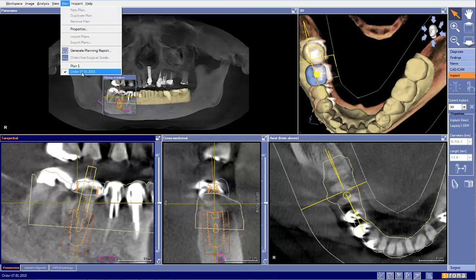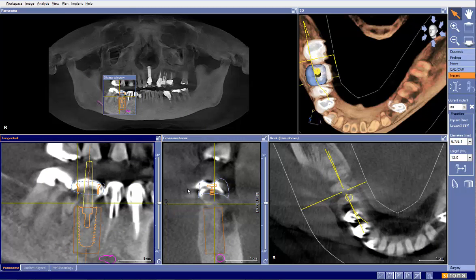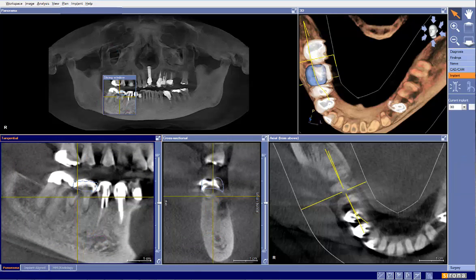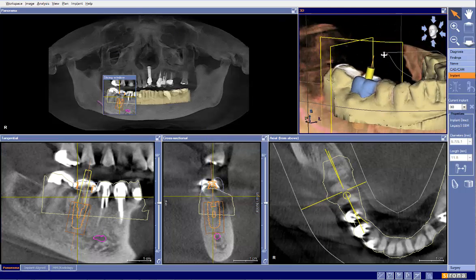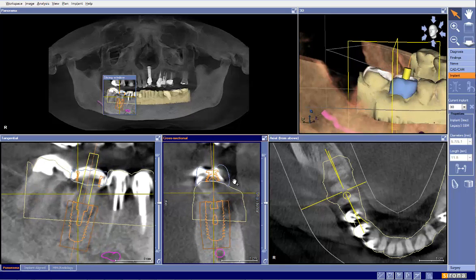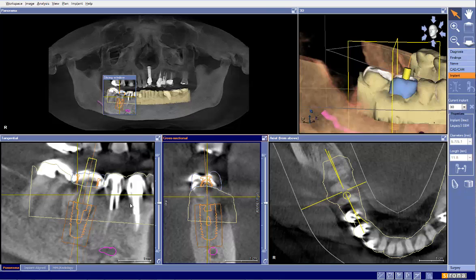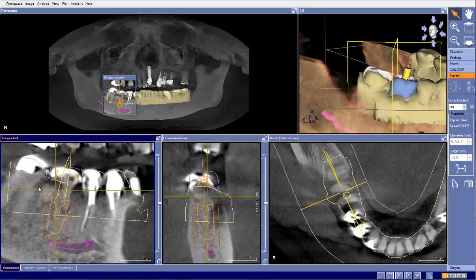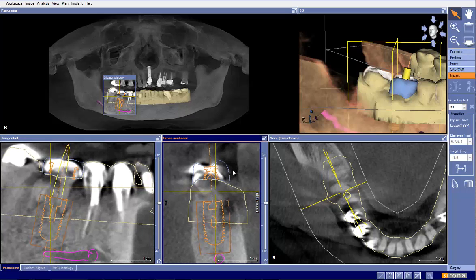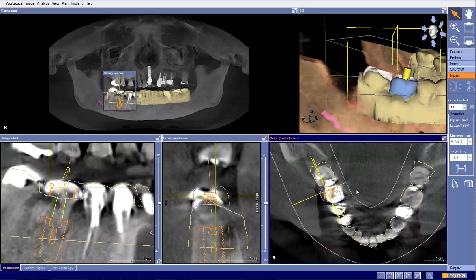As you can see here there are two plans. This is the plan for the guide that was ordered and this is a corrected plan for the implant. I have a couple of quick questions on this case. I'm a little confused by when the 3D scan was taken and when the CEREC scan was taken. In the Galileus image we have a tooth in site number 30, but on the CEREC scan we don't have a tooth in site number 30. Although that doesn't affect overall the plan or the verification integrity of the data.